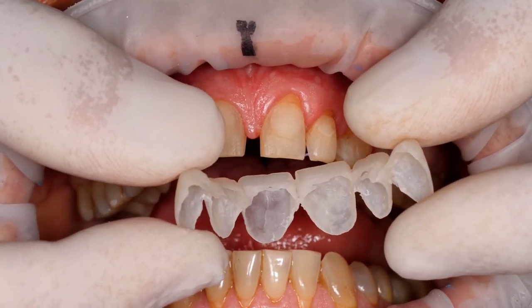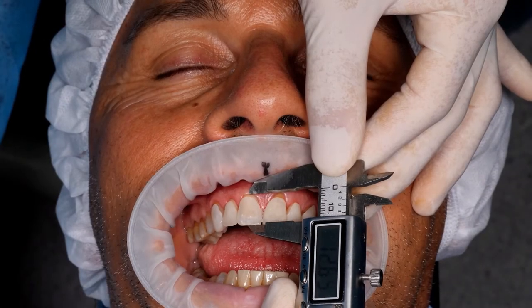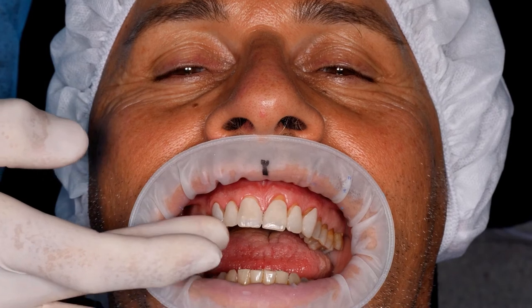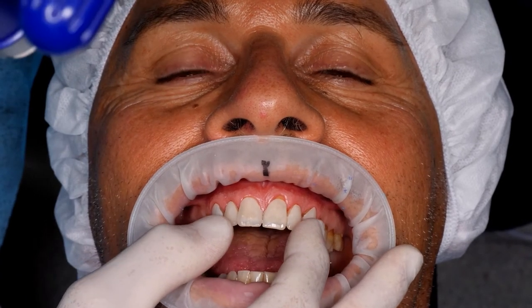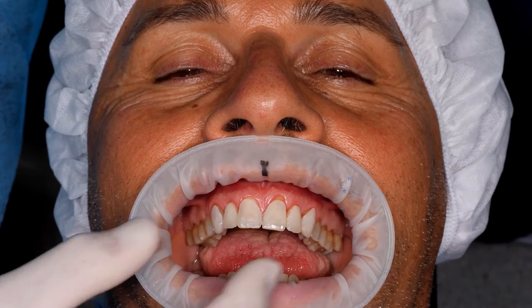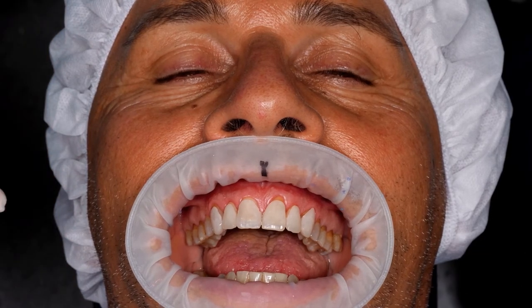However, if properly fabricated it will maintain a certain rigidity. Let's see how long it is — 12.6 mm — therefore it must be pushed down. Here we can decide whether we wish to push it down and seat it fully and then correct the plane, or leave it as it is and then lower the whole thing and work on it. We will have to work on it for a while, or we can see if we manage to seat it better.